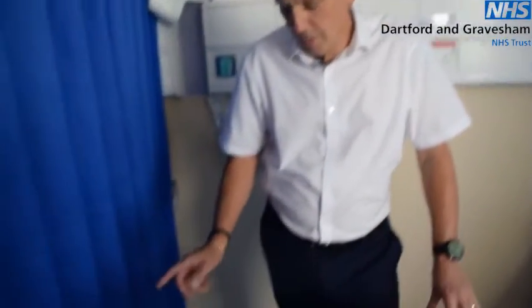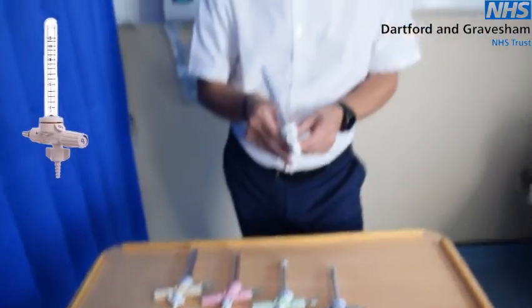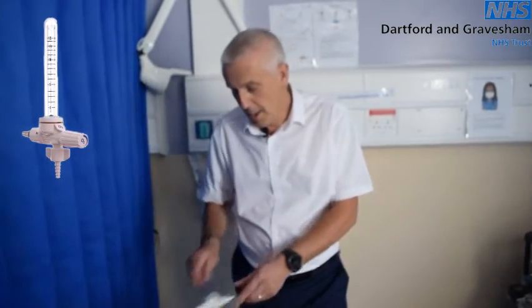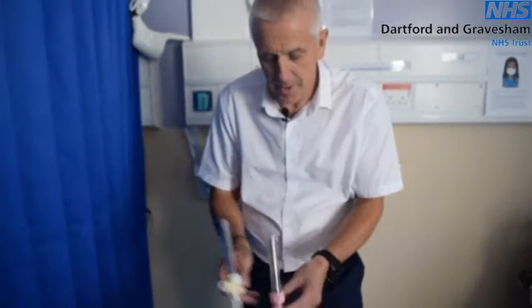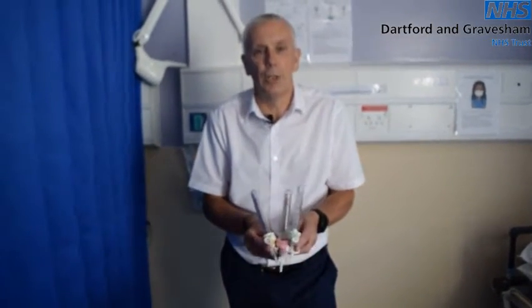Here we have a full range of the oxygen flow meters, starting with the first one which is your standard flow meter at 0 to 15 litres. This would be found on most general wards. Moving along, we have three lower flow meters which would tend to be found mainly in paediatrics, ITU and A&E.